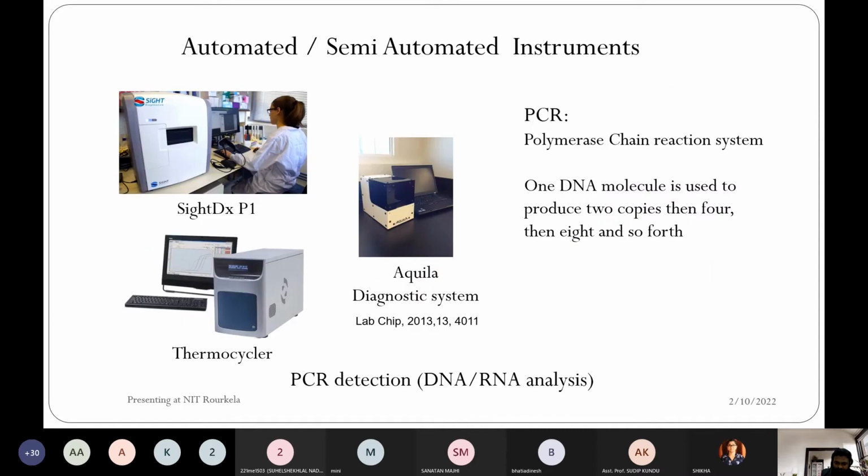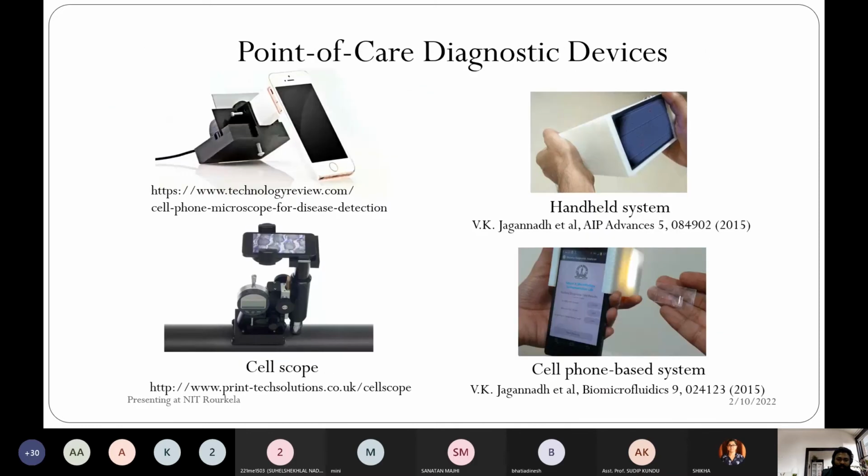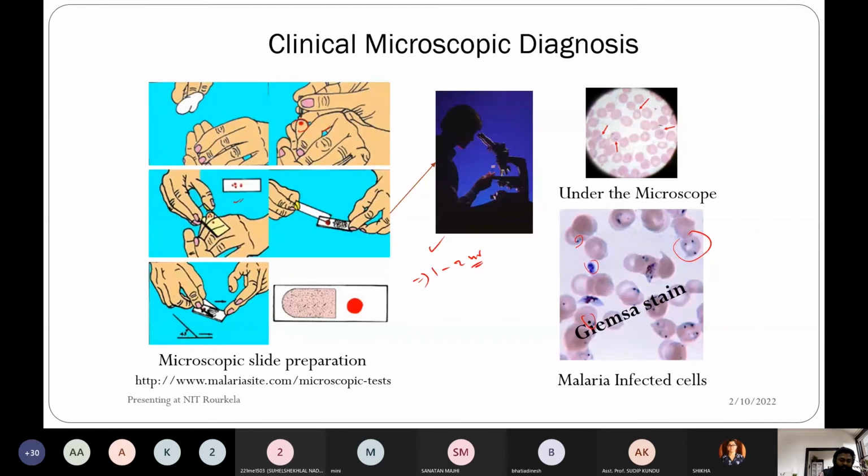Okay, so a few more things are there related to the diagnosis of malaria. We have the RDT, the rapid diagnostic test. This is a strip-based test. Basically, you will be having one strip, where one line is the control and one is the test.